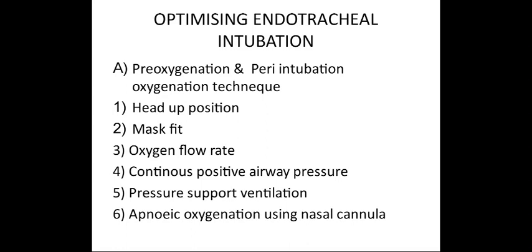Number 2, mask fit. Ensure proper face mask fit. The pre-oxygenation should be performed for 3 minutes with tidal volume breathing. It can be prolonged for 5 minutes if face mask leak is present.